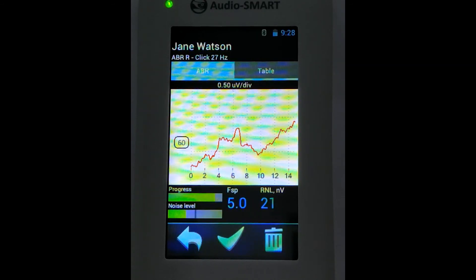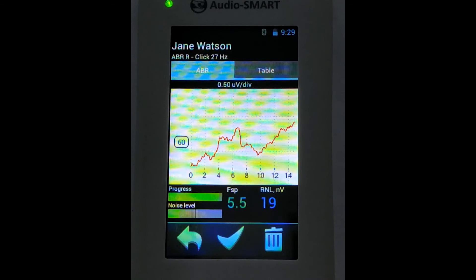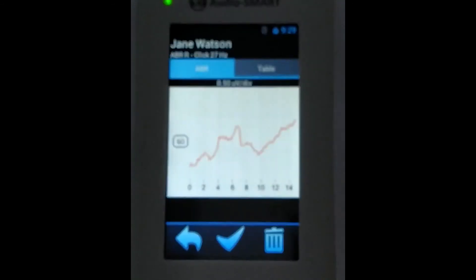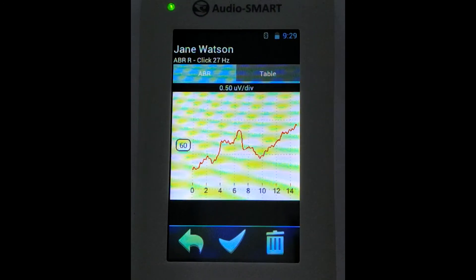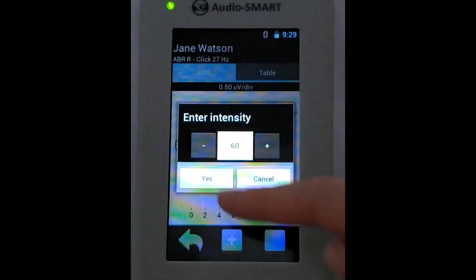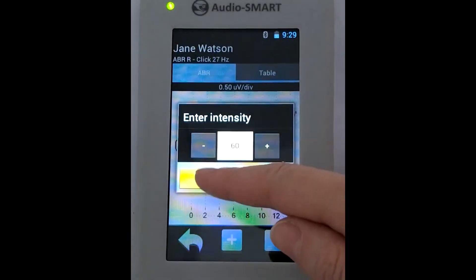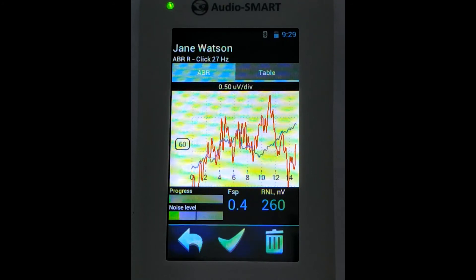We see the curve is stable enough and we see some peaks. We need to check if it is reproducible, so we will register a second curve at this intensity. We go for the second curve registration on the same intensity to see the reproducibility.